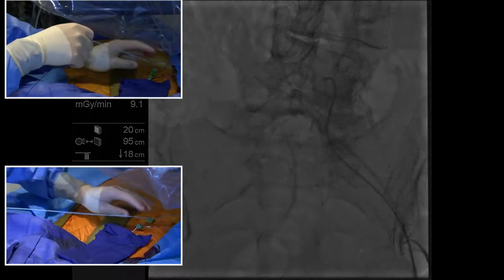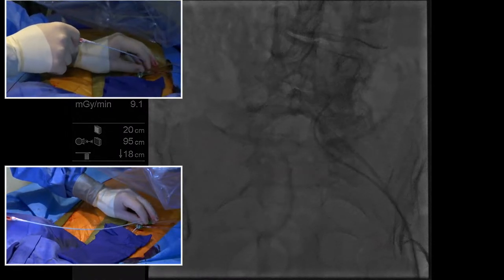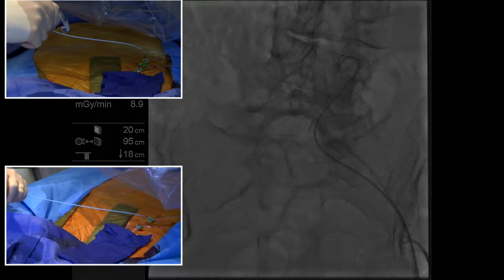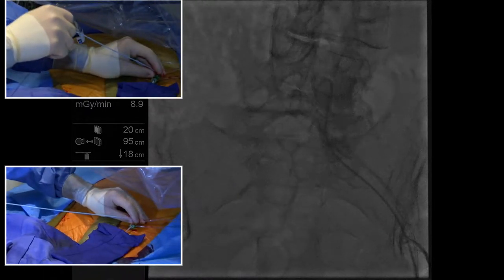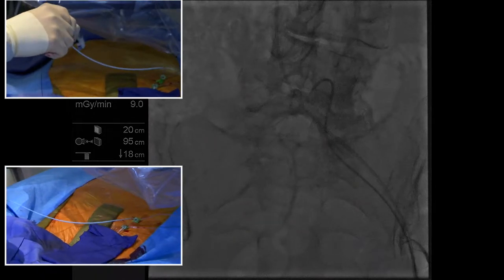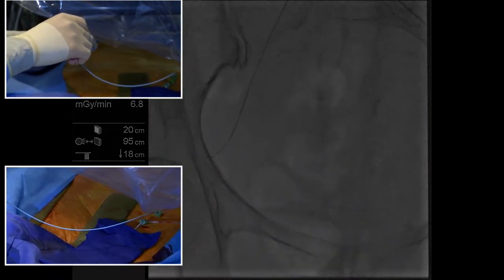No, it's not. It's a little higher up. There's some calcified plaque here, so it's making our lives a little bit miserable. Okay. There we go. That's looking better. There it is. Okay. Just took a while. There's a plaque sitting right there. So I'm going to pass this wire down.